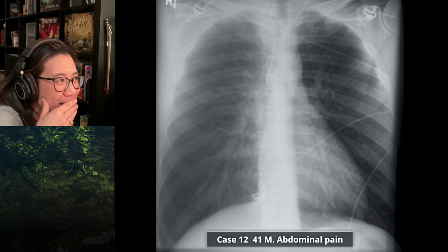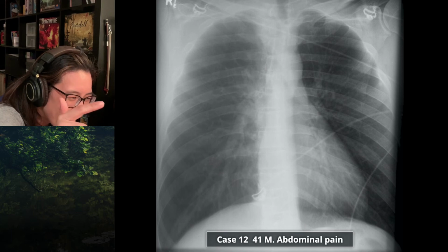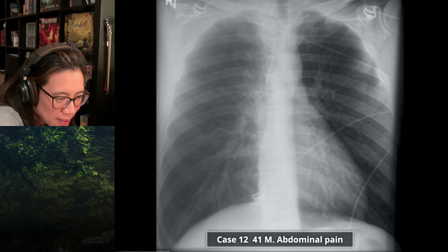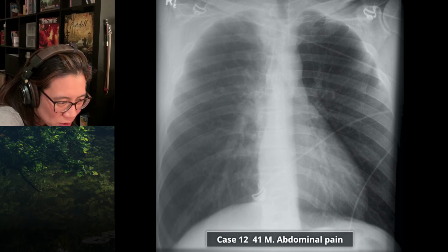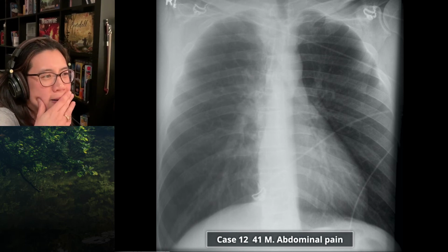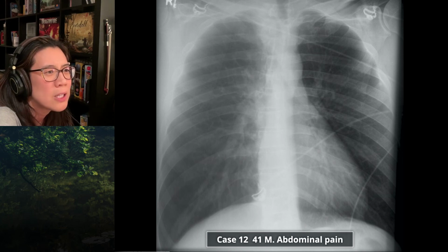Well, I can see the label, and take that back. I think that the margins of the vessels look quite different. I can see very crisp margins of the vessels on the left side, patient's left, but on the right side, those margins are very blurred. So I don't know whether that contributes to the assessment that I think it's technical.